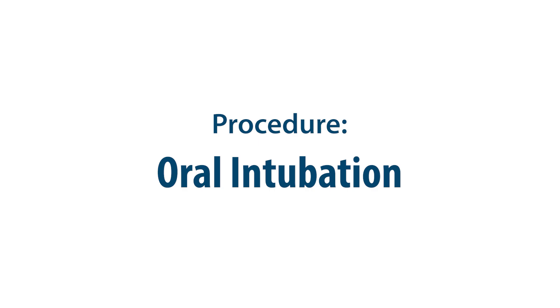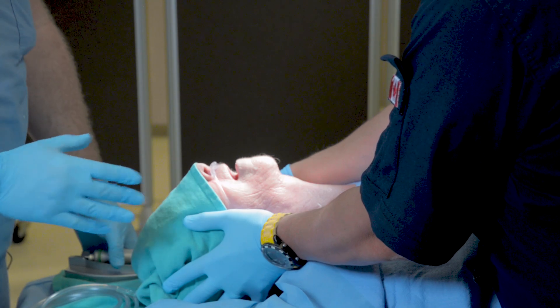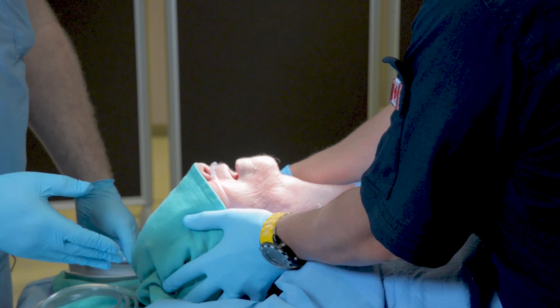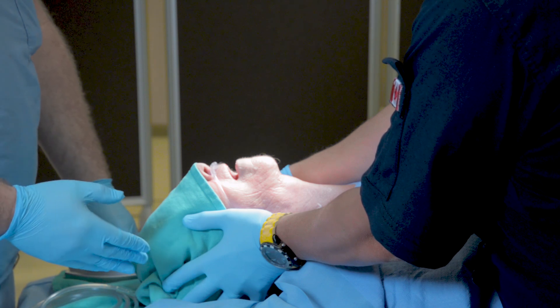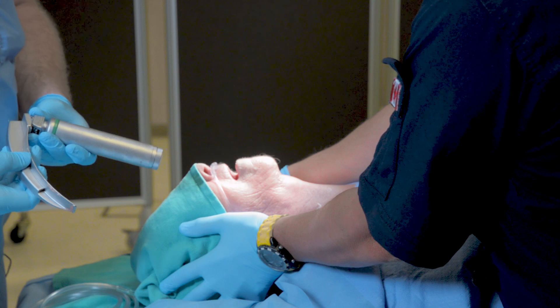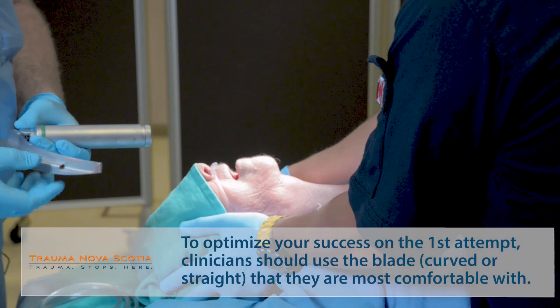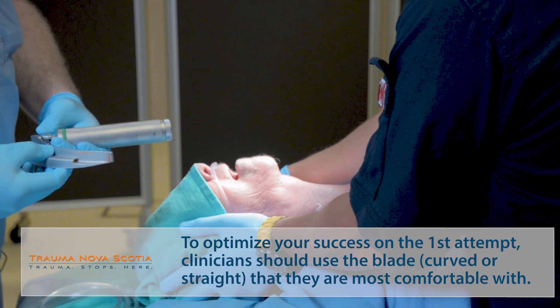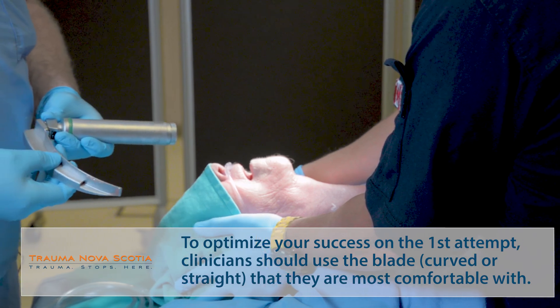Intubation with direct laryngoscopy in trauma patients is going to be done consistently with inline stabilization, with a C-spine collar opened or removed. You're going to begin with a laryngoscope, choosing the appropriate blade — one that you are trained with, that you practice with, and that you're comfortable with. In this case, we're going to use a Macintosh IV, a curved blade.